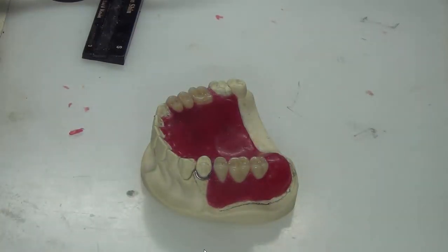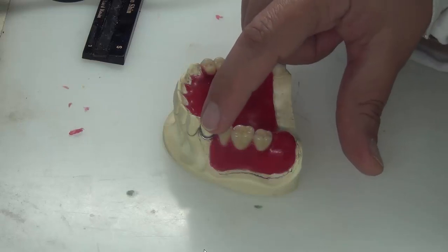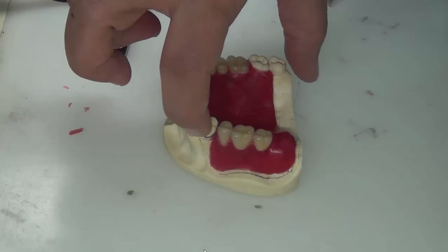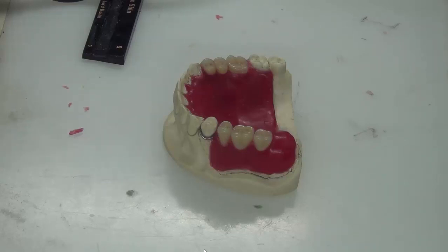The third step is removing the teeth above the survey line in the areas that we have natural teeth. To understand it, you will see it later inside the flask. But the idea is that once we have drawn our survey line and we are above it by the wax, okay? We need these teeth to have no undercuts while flasking, because in the flasking procedure, we want to make sure that the upper and lower flasks separate easily. So if there are any undercuts here, it will cause the denture to fracture while deflasking. To make an easy removal from the upper and lower members, we do trimming by the following.